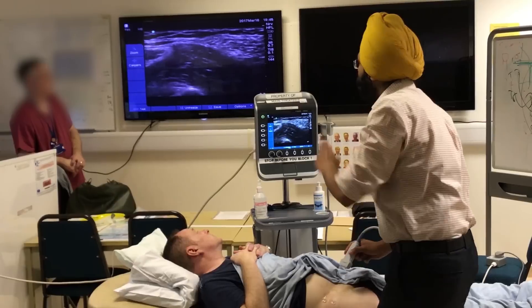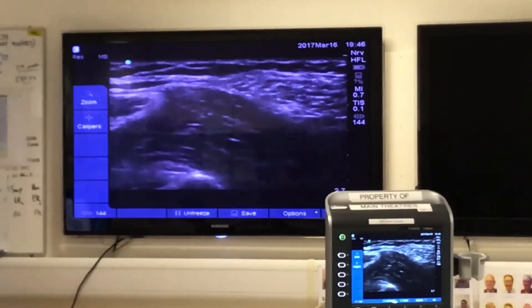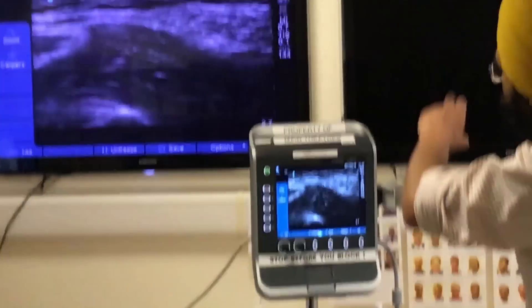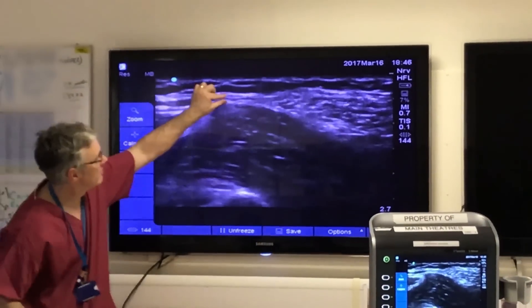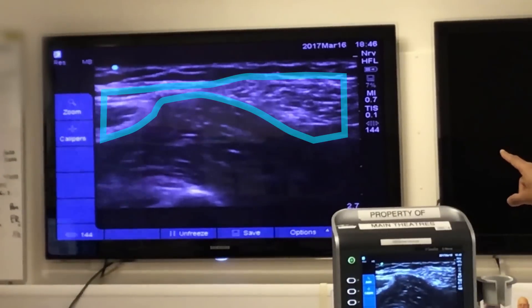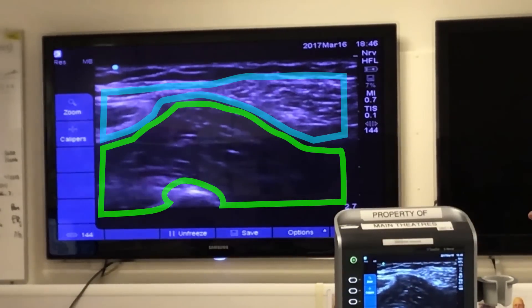So I'm going to freeze it there. How easy was that? All you need to do is find your anterior superior iliac spine - it's very easy, no one has missed it. Put a probe there and just move an inch in the line of the inguinal ligament, then you come to that pattern. When you see that pattern, it's called an hourglass - or people have described it as a bow tie. You can see three different muscles: an hourglass with a muscle on the left and right hand side, and a more circular muscle beneath.